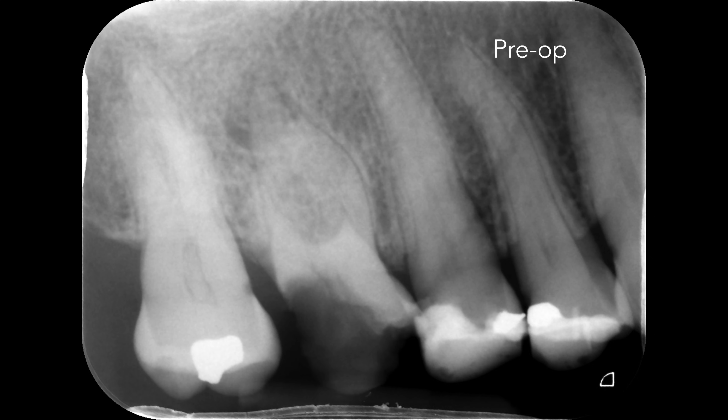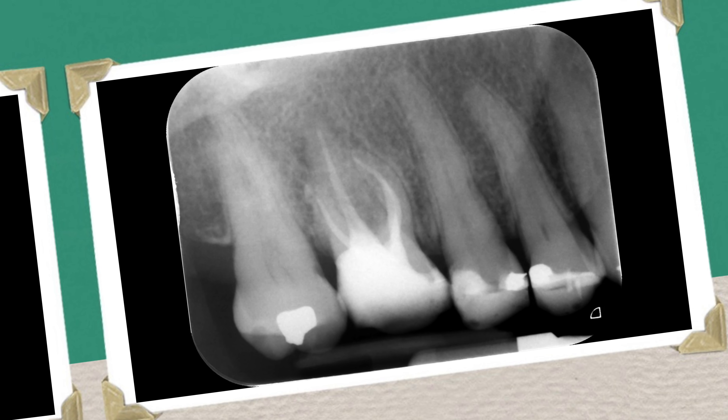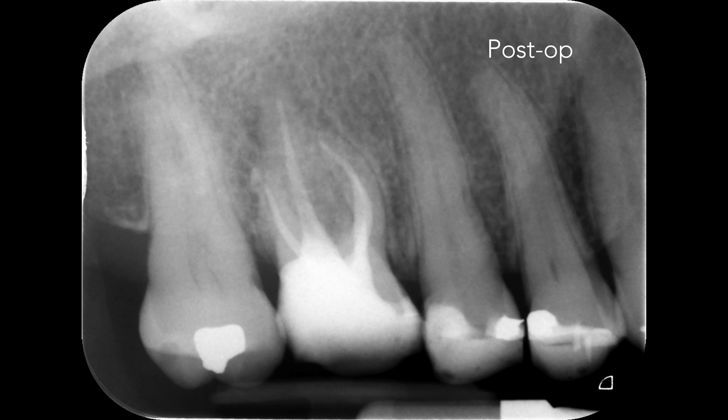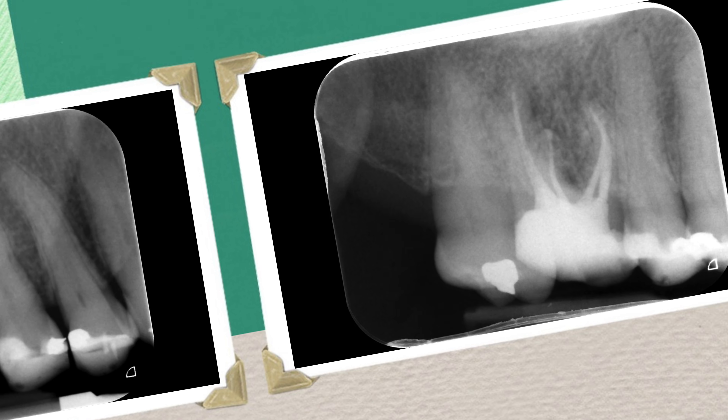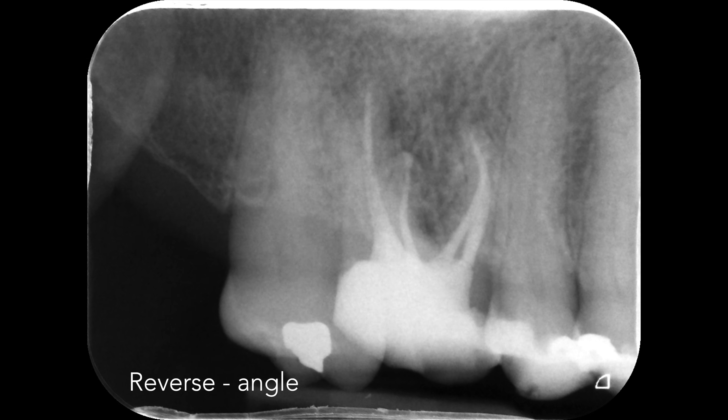To round up, we can see the pre-operative radiograph with the periapical radiolucency. The final radiograph post-operatively shows a good coronal-apical seal, and the reverse angled view clearly shows the MB1 and MB2 canals.